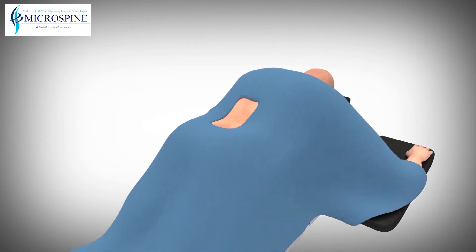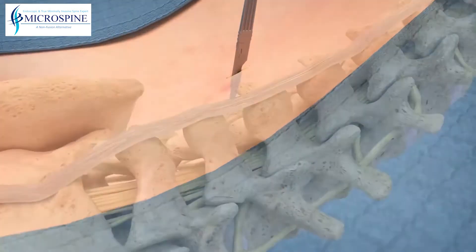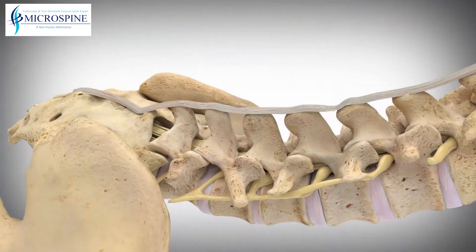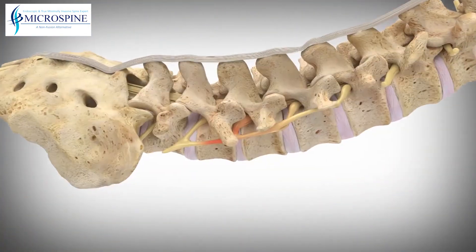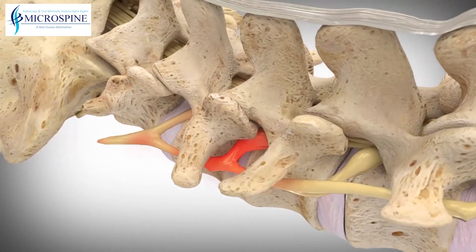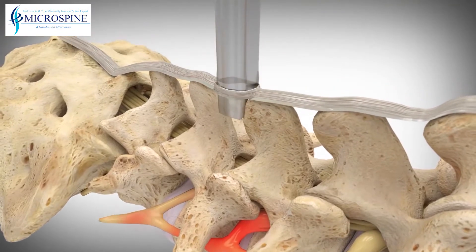The procedure can be performed in either the hospital operating room or an outpatient surgical center. This simple procedure is done through a small incision made in your lower back. The Superion implant is placed between the vertebrae and holds them open, which relieves pressure on the nerves in the spinal canal.